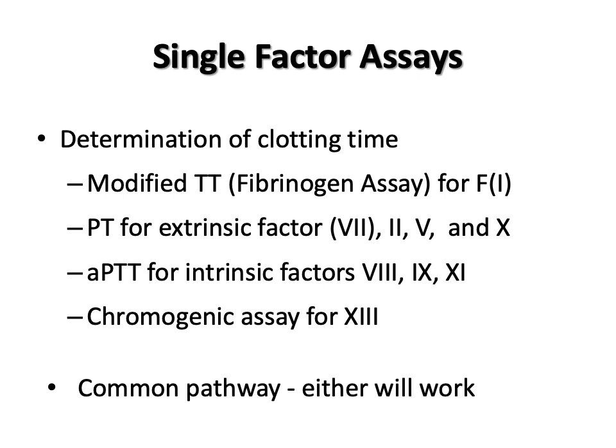So, for example, to identify a factor 1 or fibrinogen deficiency, a modified thrombin time is performed using patient plasma mixed with factor 1 deficient plasma. If the thrombin time is prolonged, or it does not correct, the patient has a factor 1 deficiency.